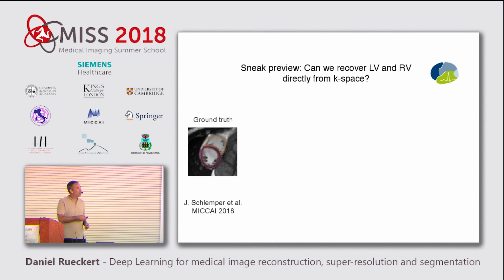So this will not produce an image reconstruction as a byproduct, which poses a lot of challenges for how you validate this or how you detect whether it still works, but it's a very interesting approach, and it basically tries to optimize the whole imaging pipeline.